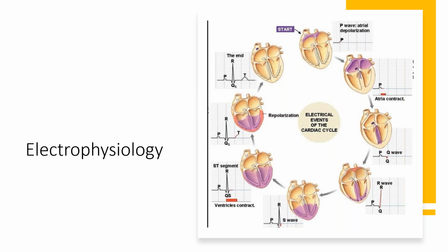Then the R wave, which is the big up-sloping part of that wave. I always remember, the big part goes with the bigger part of the heart, the more muscular part of the heart, which is the ventricles that pump. Both ventricles pump at the same time, left and right. Same with the atria, left and right pump at the same time. That part is called the QRS complex: the small wave at the beginning, the tall wave, which is the R wave, and then the S wave at the bottom.